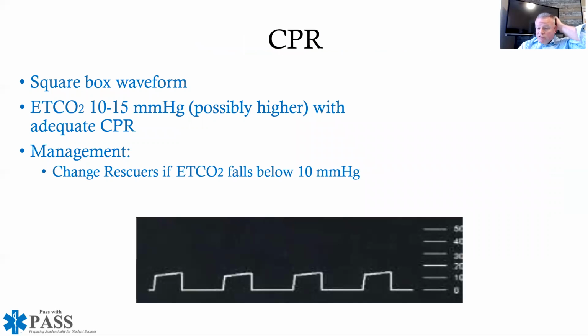All right, CPR. From an equipment perspective, and I'm not here to promote any products, we use the Physio Control Lucas device, which is now through Stryker. Our folks love it, okay? So we take the Lucas device, we put it on patients, and I asked yesterday, what do you think those numbers are? In cardiac arrest, our folks feel that that number under CPR with a Lucas device applied is somewhere around 20 to 25 of end tidal CO2, and that's pretty close to probably what we're normally seeing.